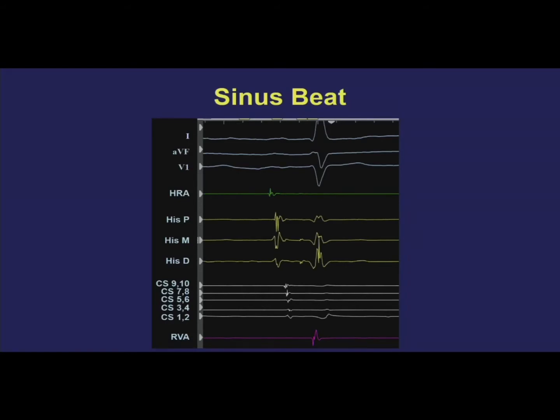How do I know it's a sinus beat? Several reasons. If you looked at all 12 leads, on the first page of the recording system, you have all 12 leads. Now only 3 of them are displayed up top. The P wave is upright in lead 1, it's upright in AVF, it's biphasic in V1. It's stretched out, so it's hard to see that shape, so you could compress it and look at it at 25 millimeters per second, or you could gain up each of these to see the P wave better. But those are tricks that you'll learn to manipulate the EKG.